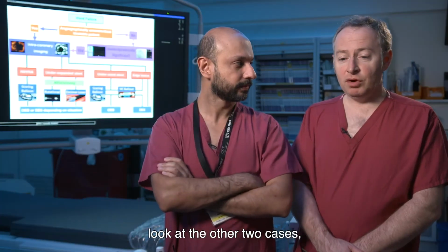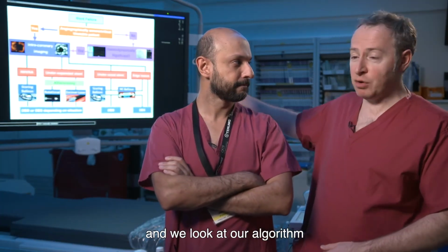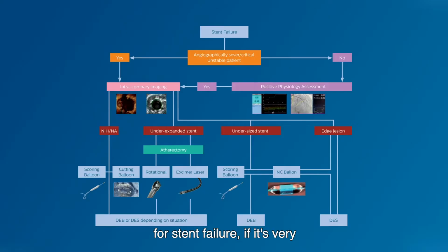And in fact, when we look at the other two cases and we look at our algorithm for stent failure, if it's very severe or critical disease, then you don't necessarily have to do a pressure wire. The second case was obviously a chronic occlusion, so clearly it was an occluded vessel, and the latter case was a very critical lesion. So you don't always have to do it, but where there's ambiguity, as Johanka says, it's the best technique.